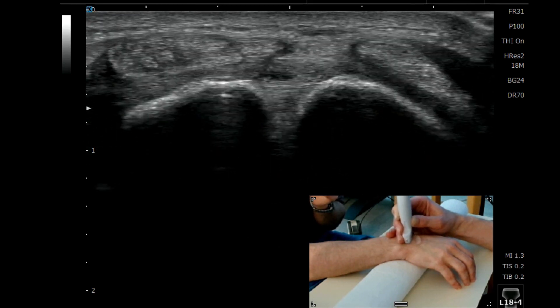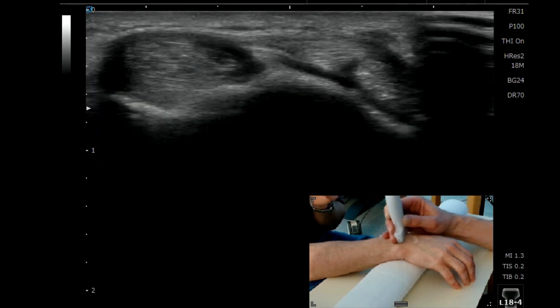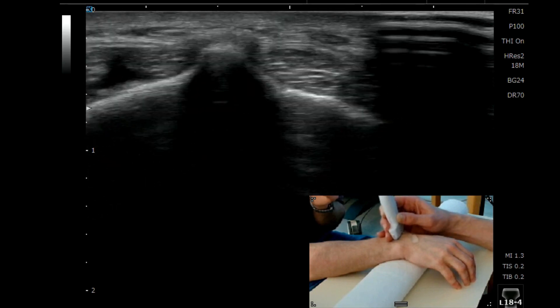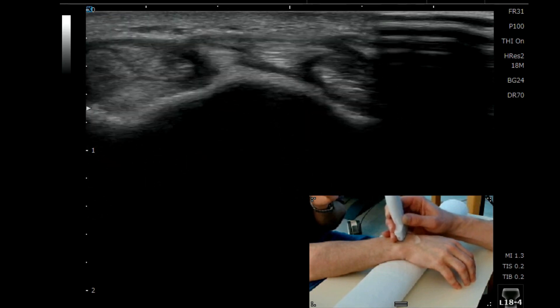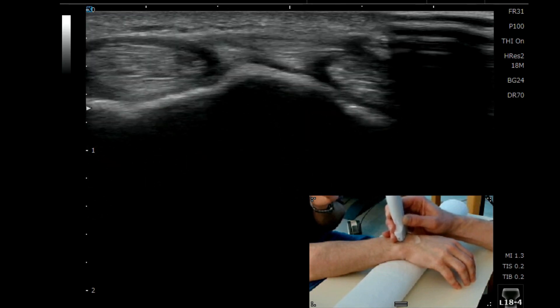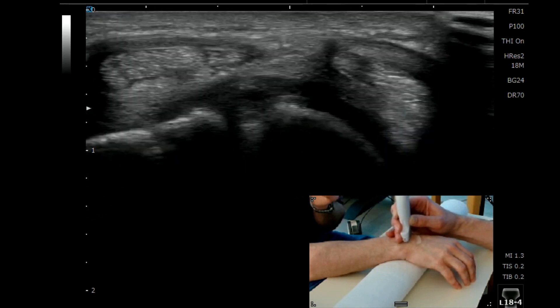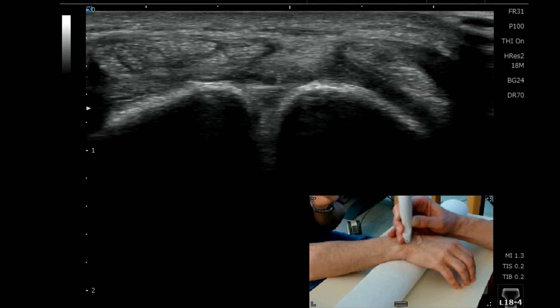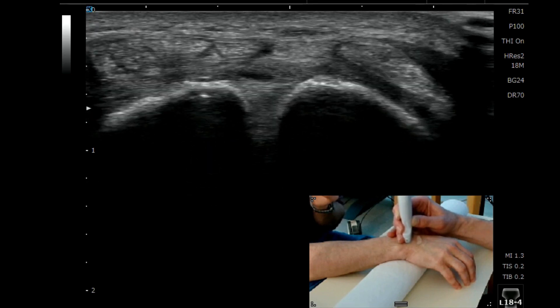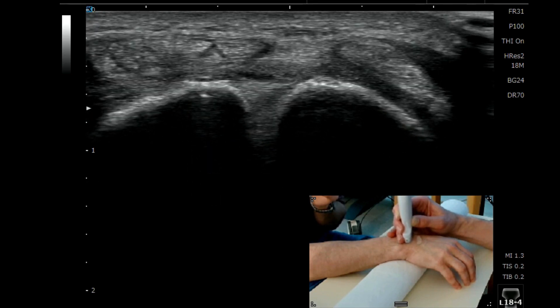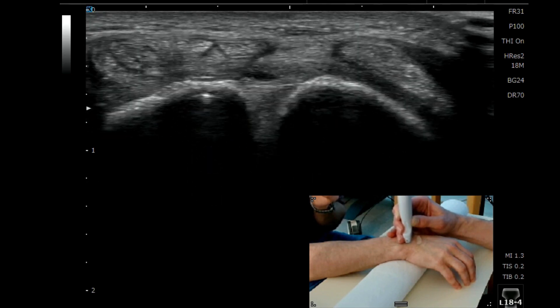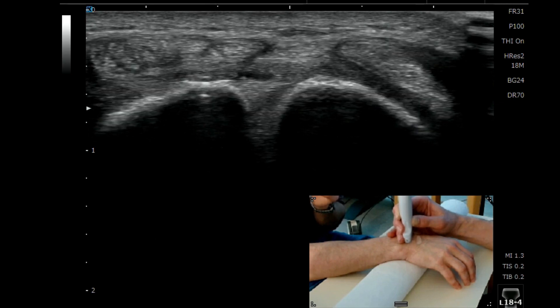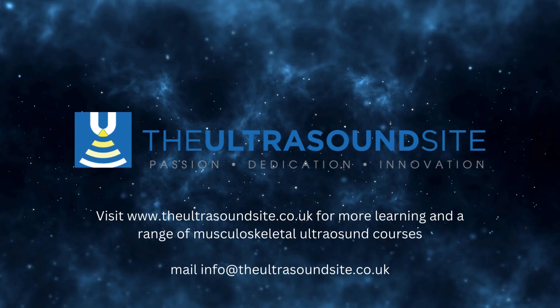That's how you find your scapholunate. Literally just find your Lister's, roll down, maybe drop a little bit more around to the ulnar aspect, find that little V-shape between the scaphoid and the lunate, and you can see those nice dorsal fibres there. Thank you very much.